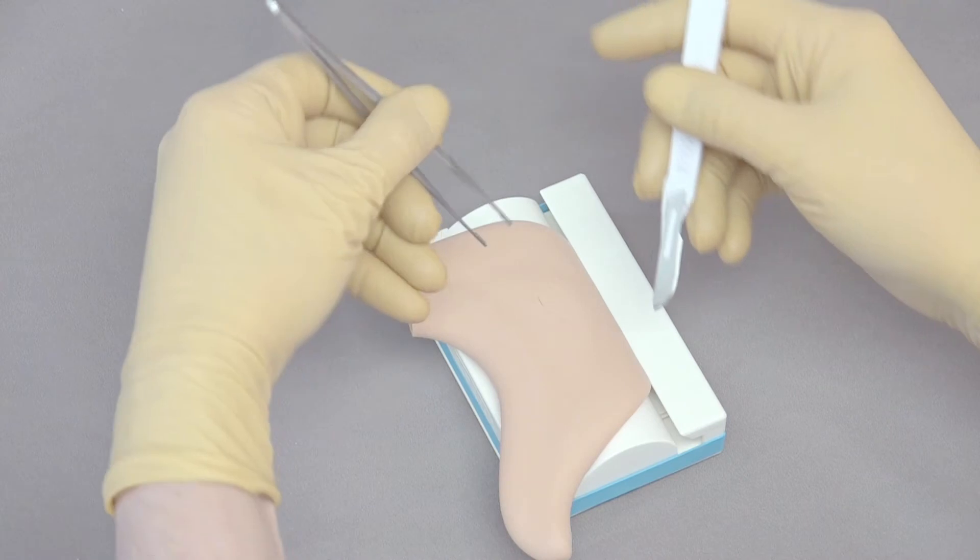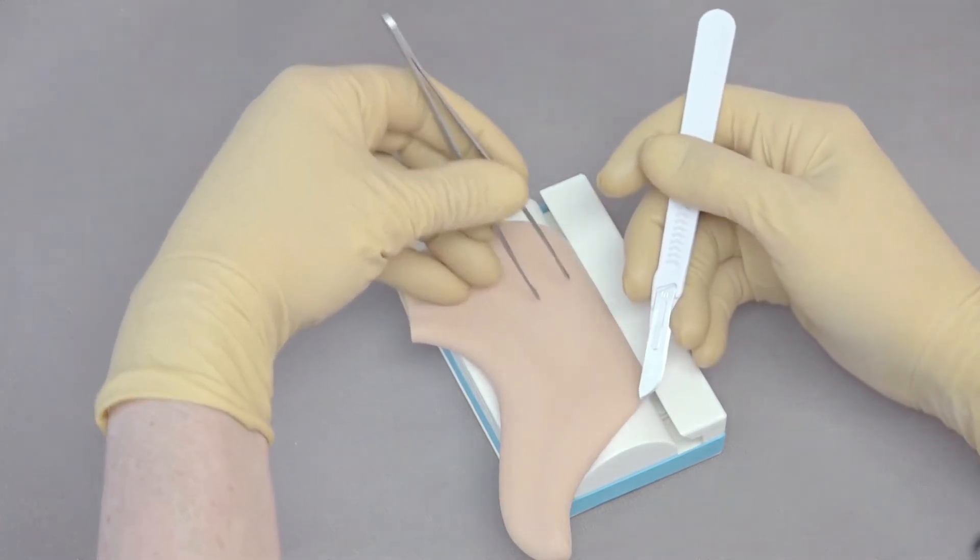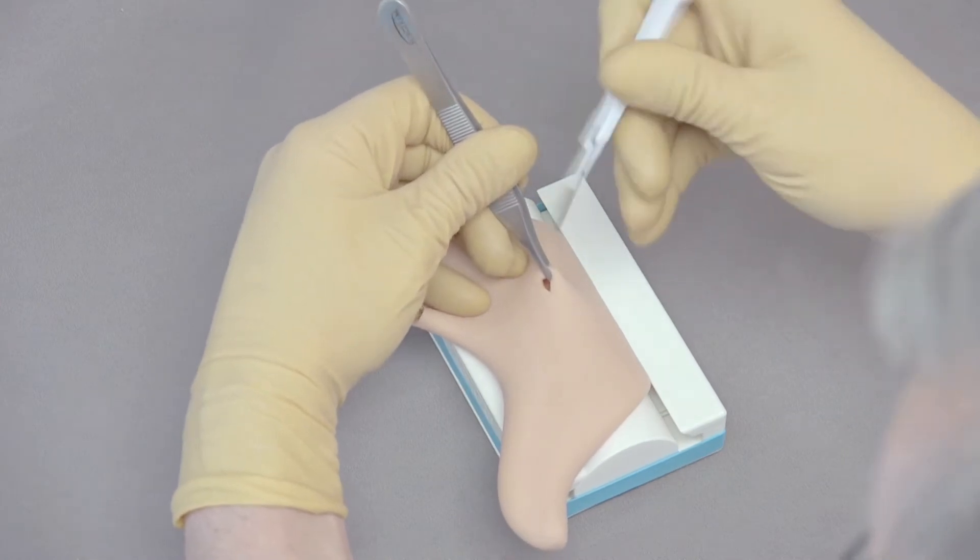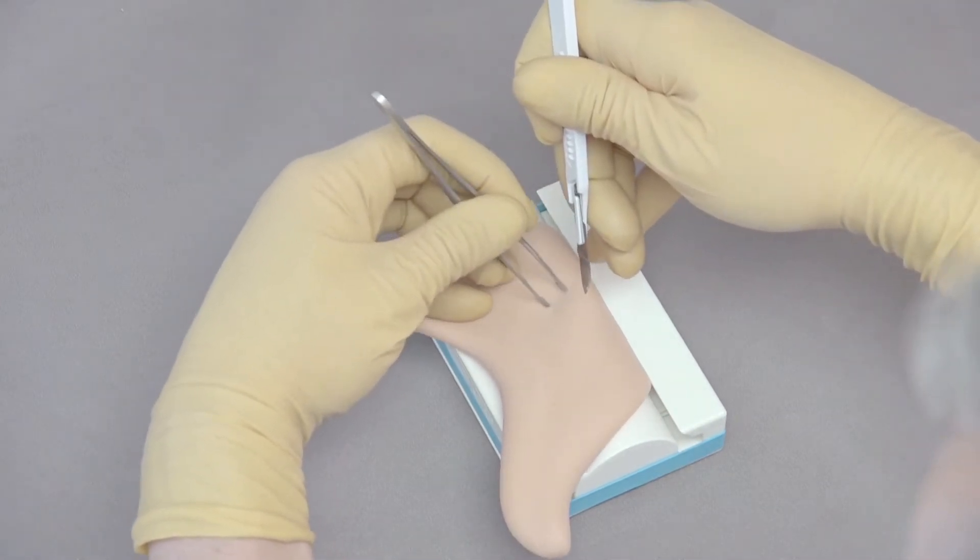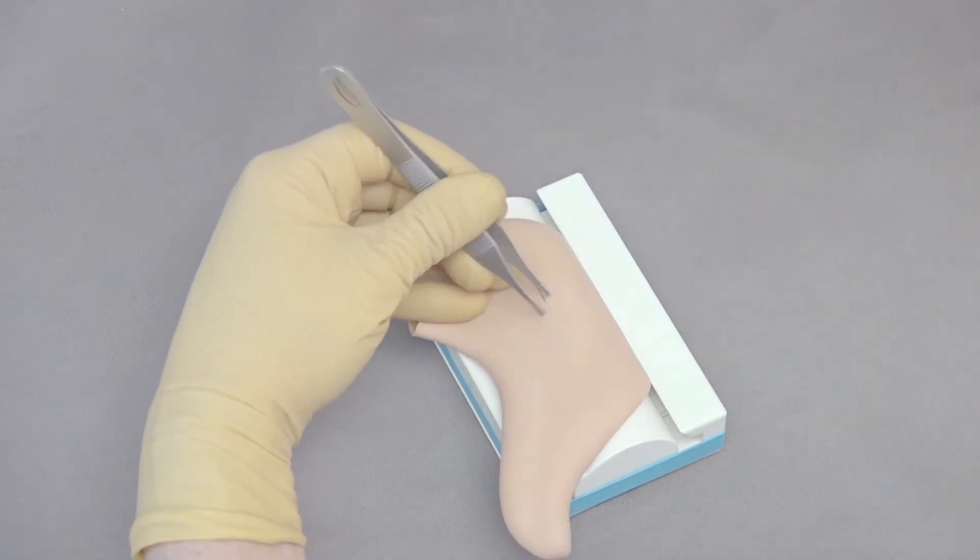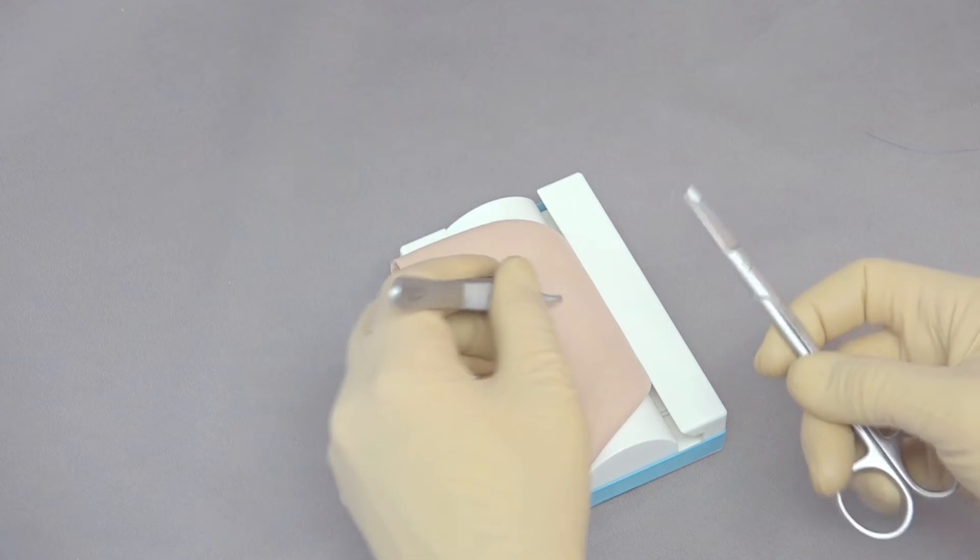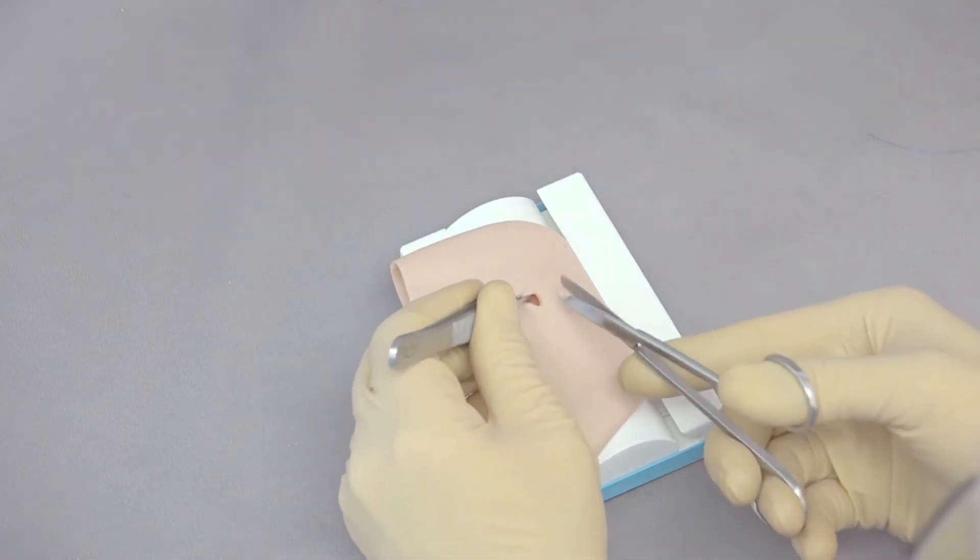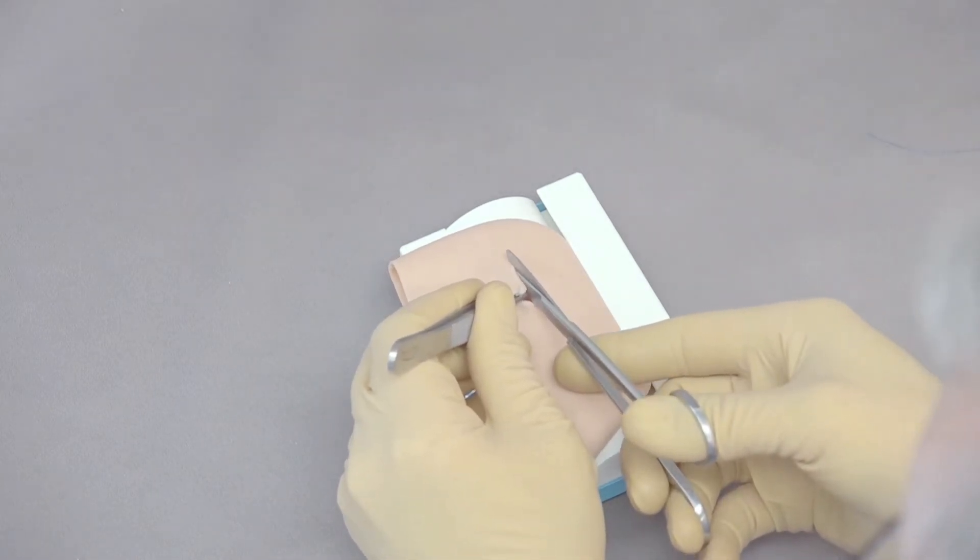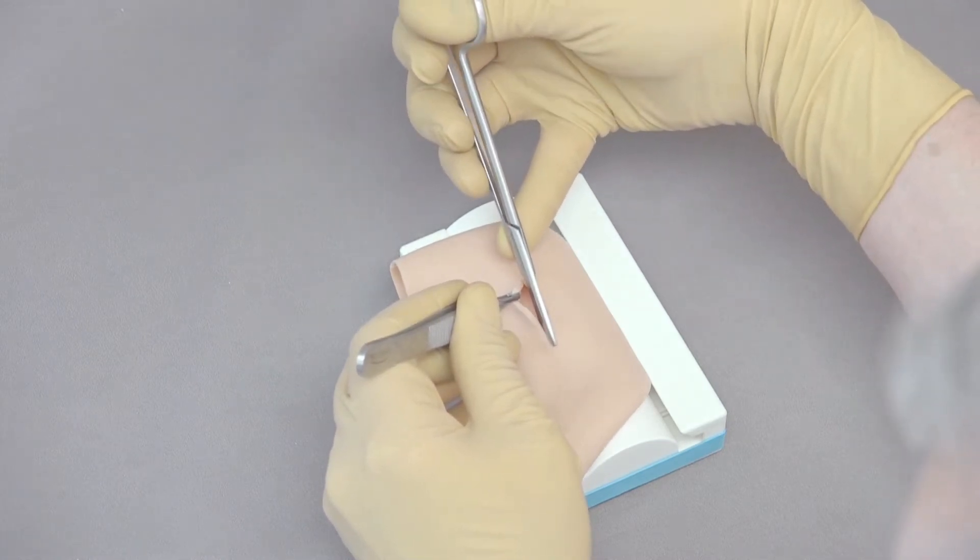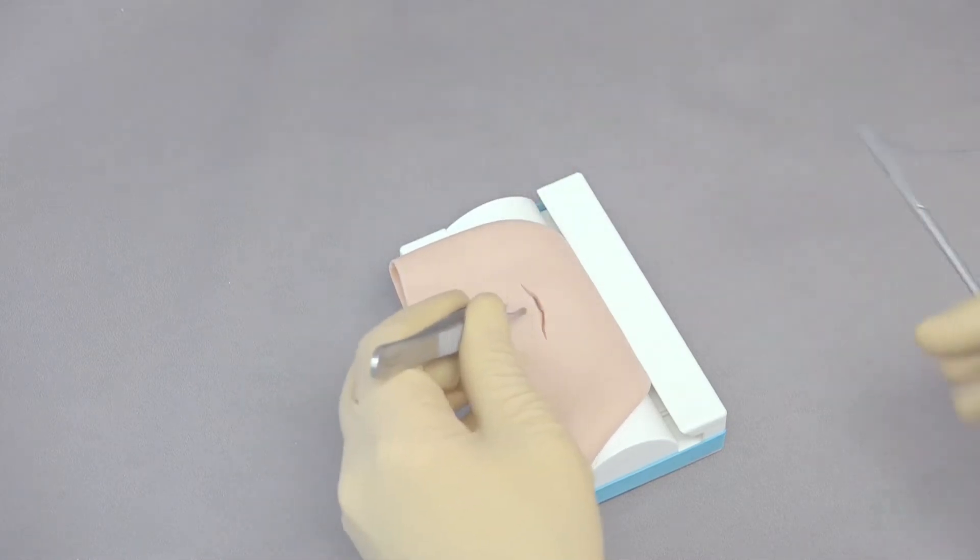We can then bring the stomach up again with now the thumb forceps in the lumen of the stomach, and use the blade to make the incision bigger, or we can actually in most cases use the scissors to accomplish that. We're going to hold this up, and then come in with the scissors to make that larger, and we can come back the other way. That will give us the incision in the stomach.